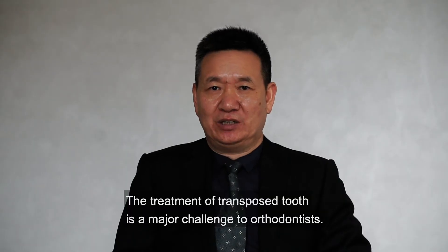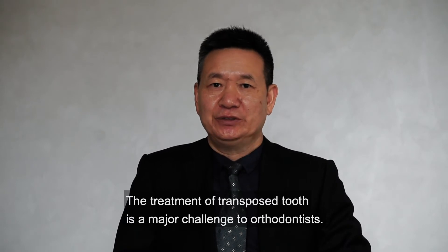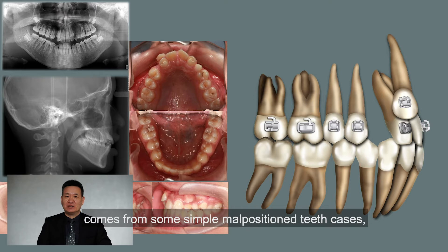The treatment of transposed teeth is a major challenge to orthodontists. My philosophy for correcting these transposed teeth comes from some simple malpositioned teeth cases.